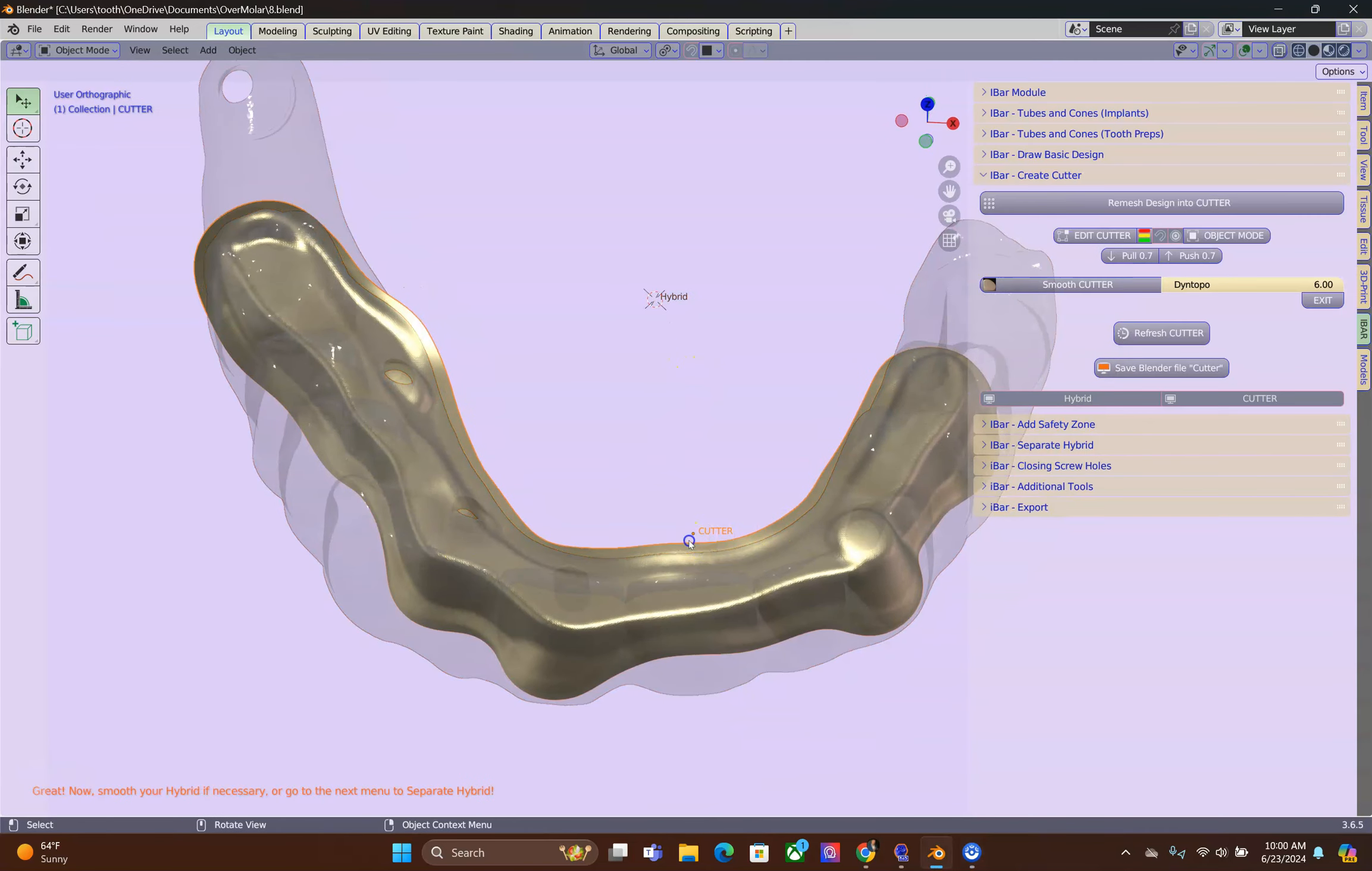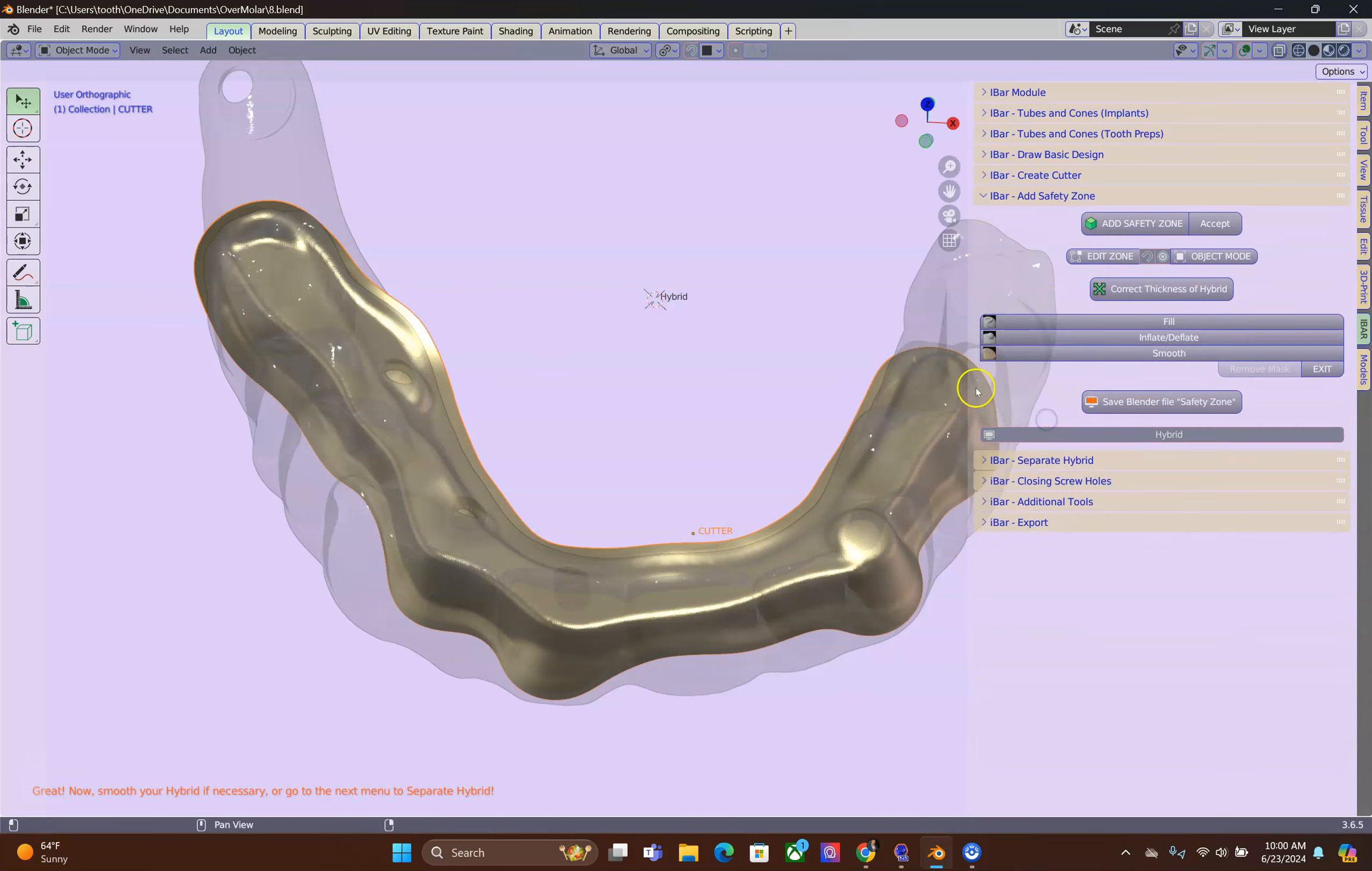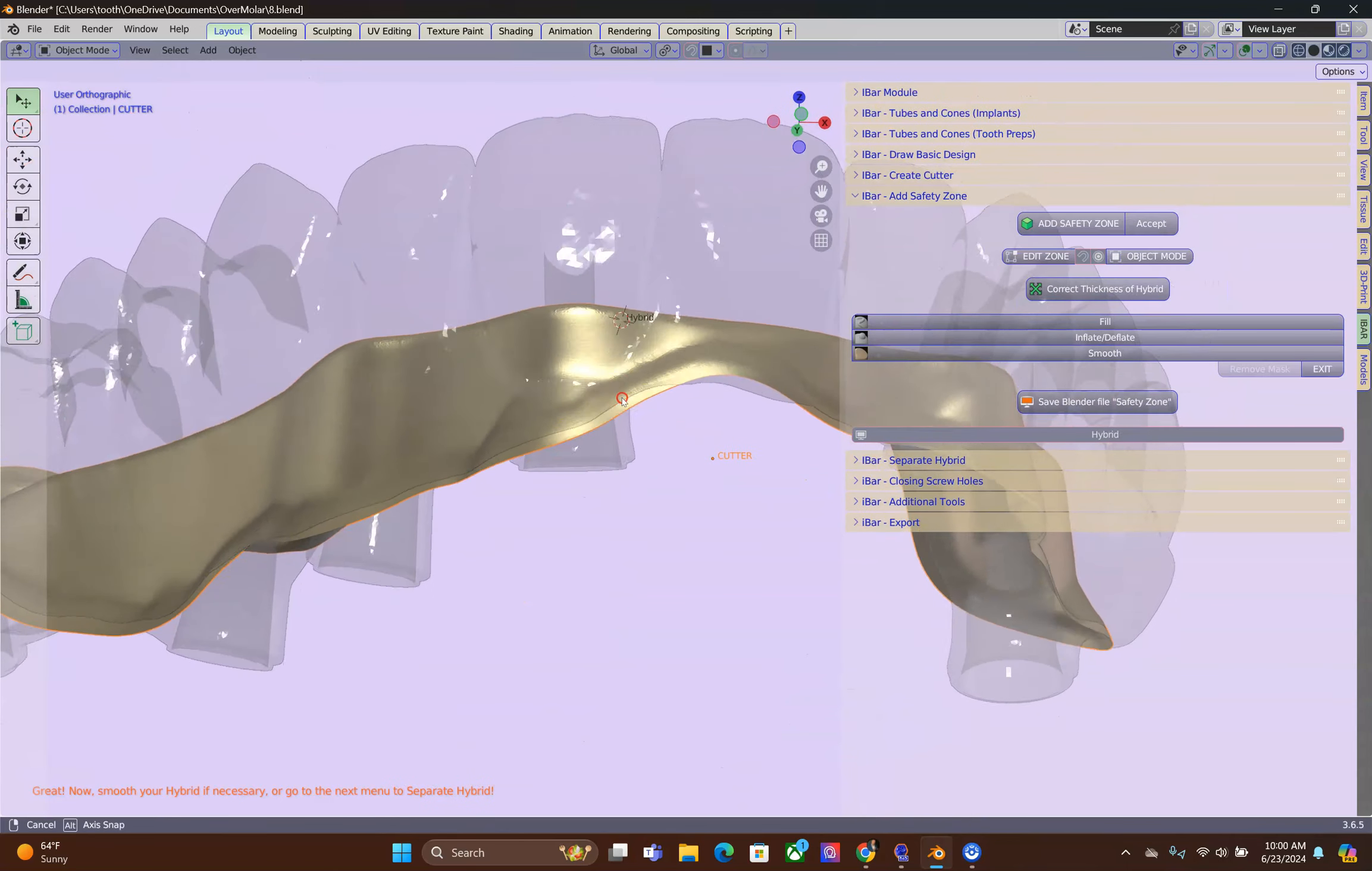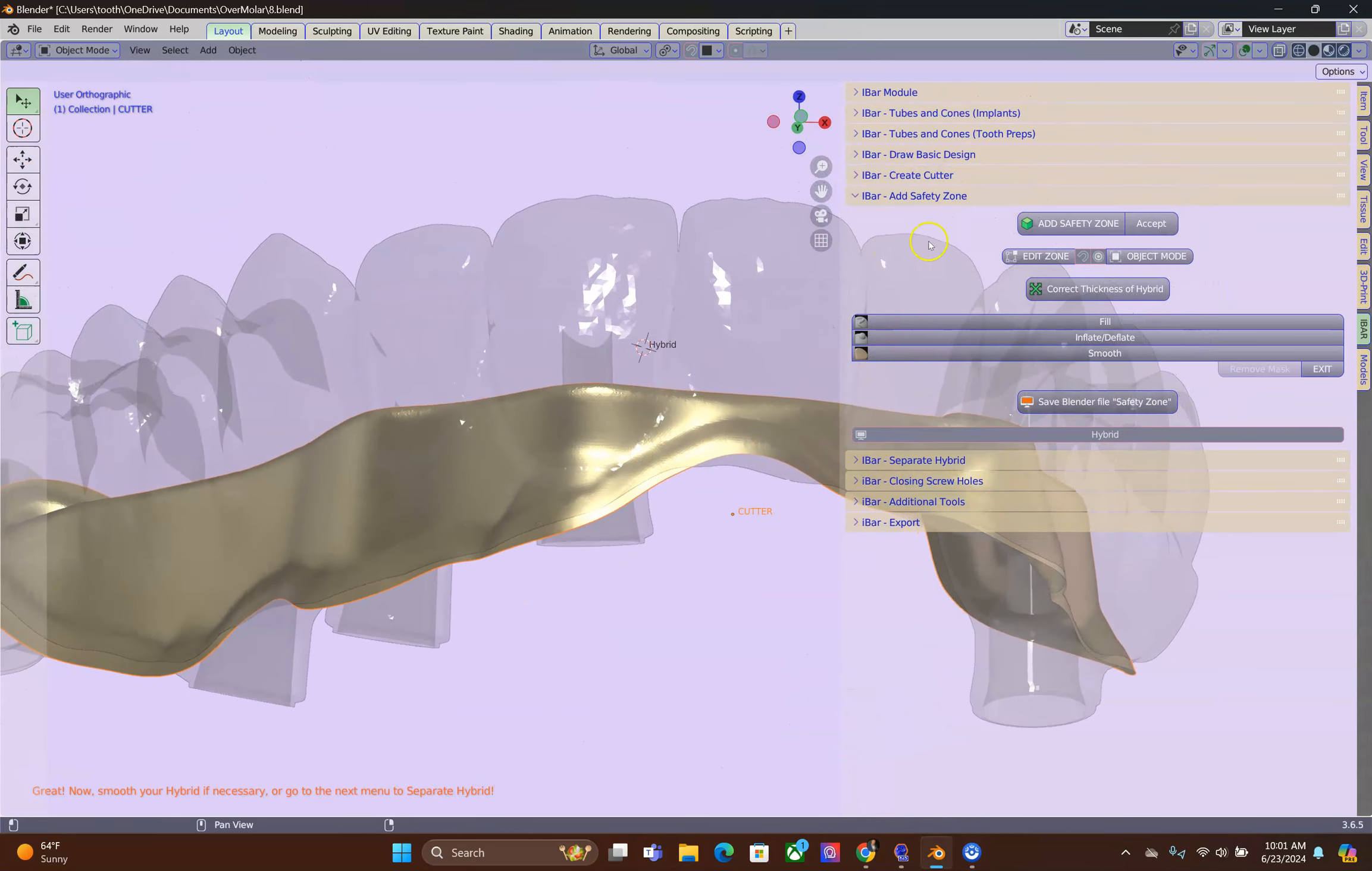Next, select your cutter. Go to the Safety Zone. This step is important because we need to make sure that the hybrid shell is thick enough.